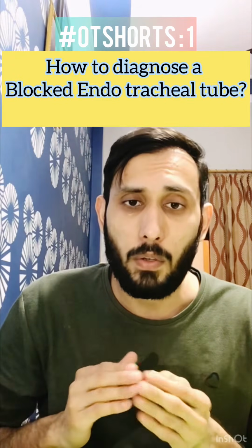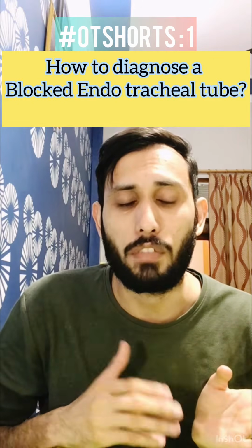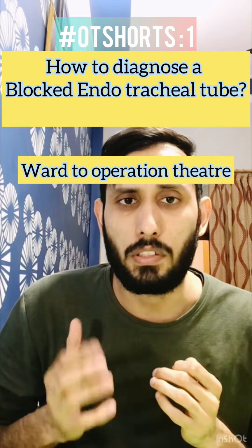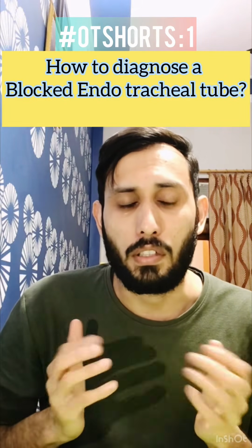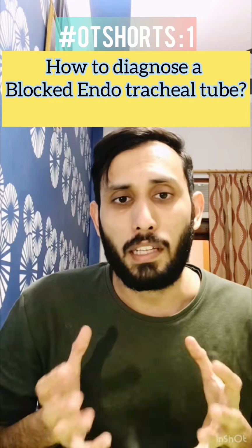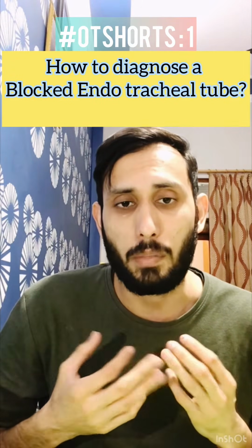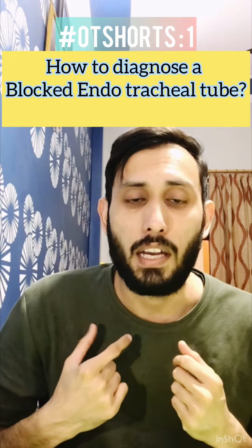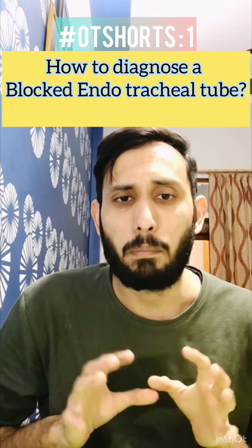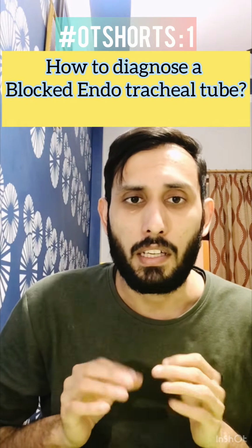The second scenario is when you do not know when the tube was last suctioned. Suppose the patient was shifted from the ward to the operation theater on an ambu or Jackson Rees circuit, and the person bringing the patient has not checked the bilateral air entry. At that time, you have to take the patient inside the OT, attach the monitors, especially the pulse oximetry, check for bilateral air entry, and try to do the suctioning. If you do have time and there's some partial air entry, you can give 100% oxygen and do the suctioning comfortably.